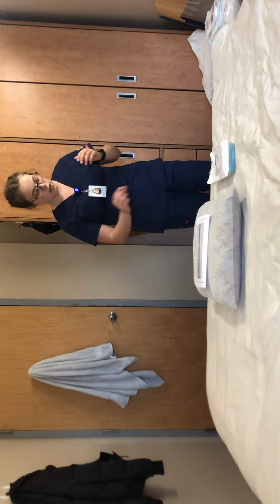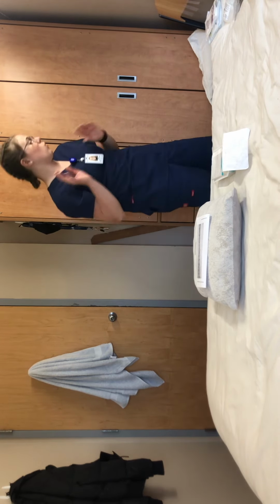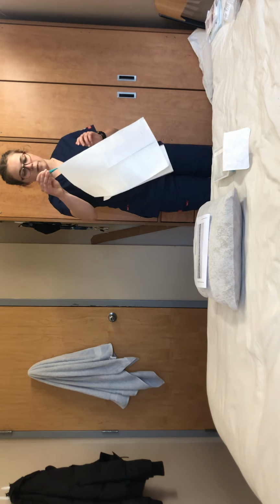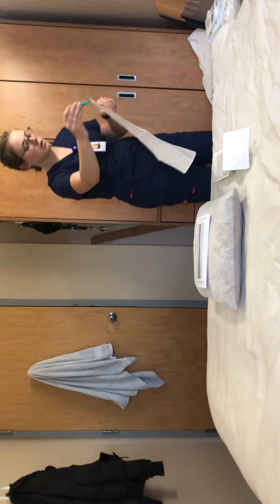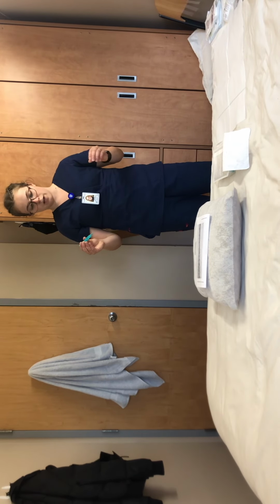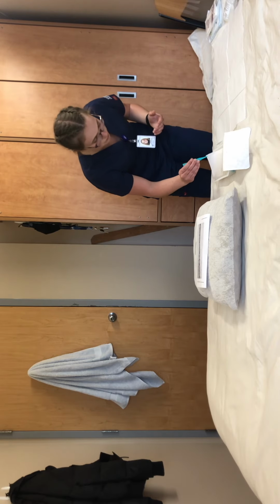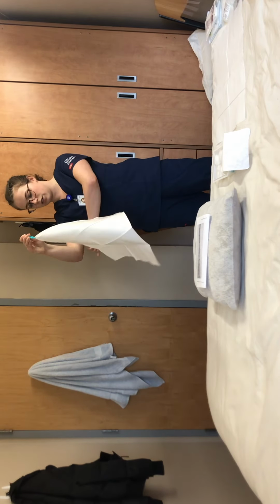So what I will be doing is I will be opening up my dressing tray away from me. Then I'll be getting the tweezers, and I'll be getting one of the drapings, opening it up, making sure that I do not shake it. And I will be placing it with the shiny side downwards. Then I will be putting the other draping underneath the patient. So I'll be asking the patient if they could please either roll over slightly, or if they could lift their leg up so that I can place the dressing underneath them.